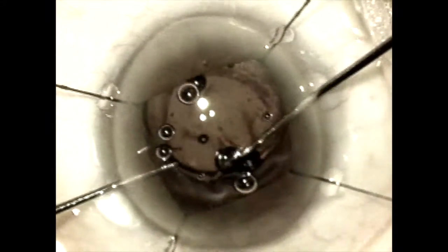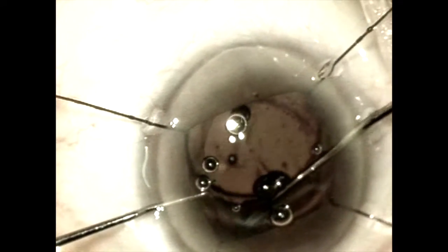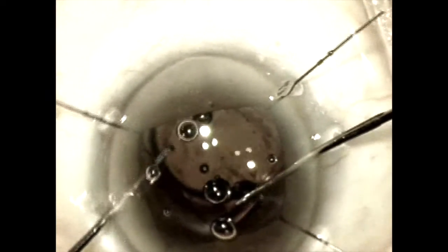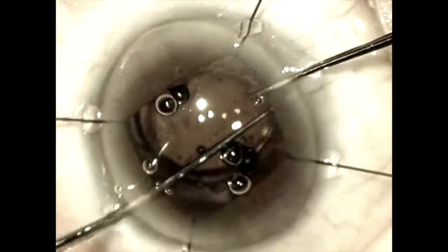This is a patient with negative dysphotopsia. She has a hydrophilic acrylic implant that has been in place in the eye for over a year and she has pseudo exfoliation syndrome. We have elected to exchange this lens.